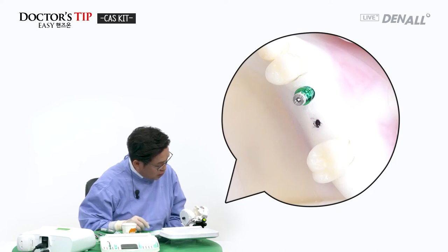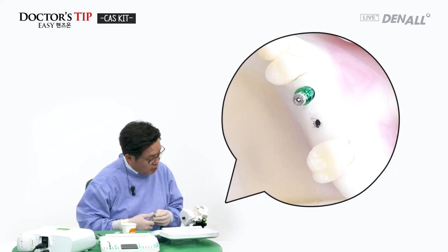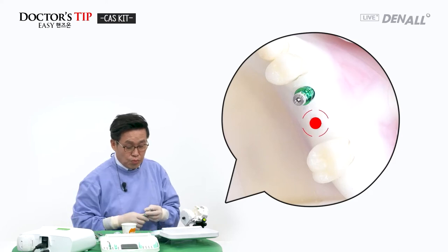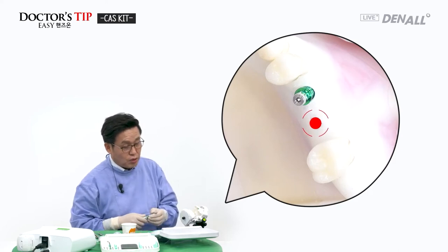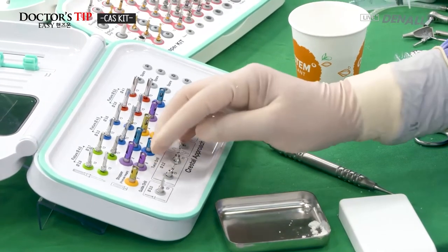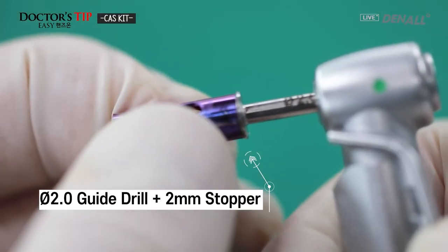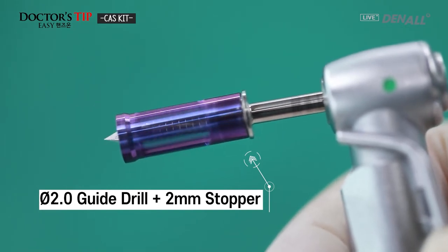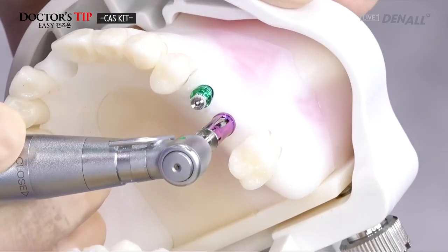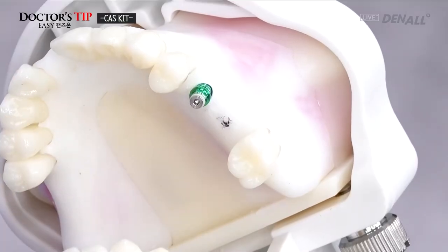And for hydraulic lift, if we make two holes together, water leak can occur. So it is inserted before number 26 drilling is done. The 2.0 guide drill will mark the placement location. A 2 millimeter stopper is inserted and connected. The drill is made.